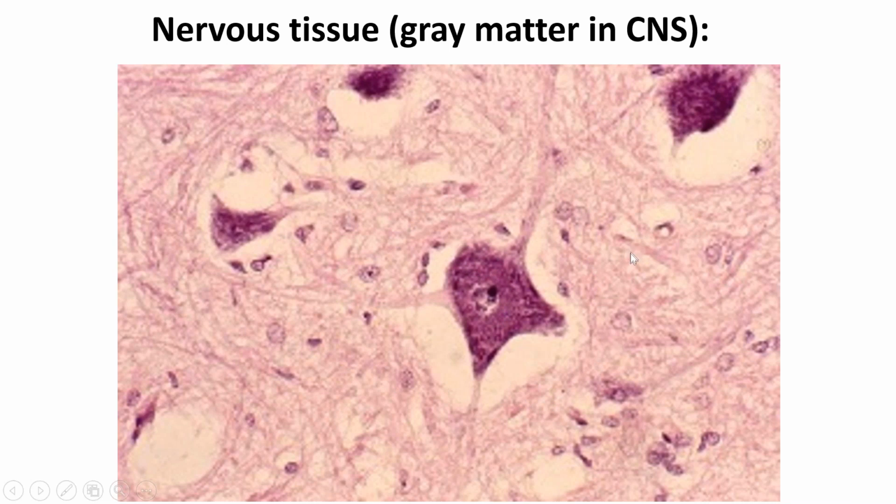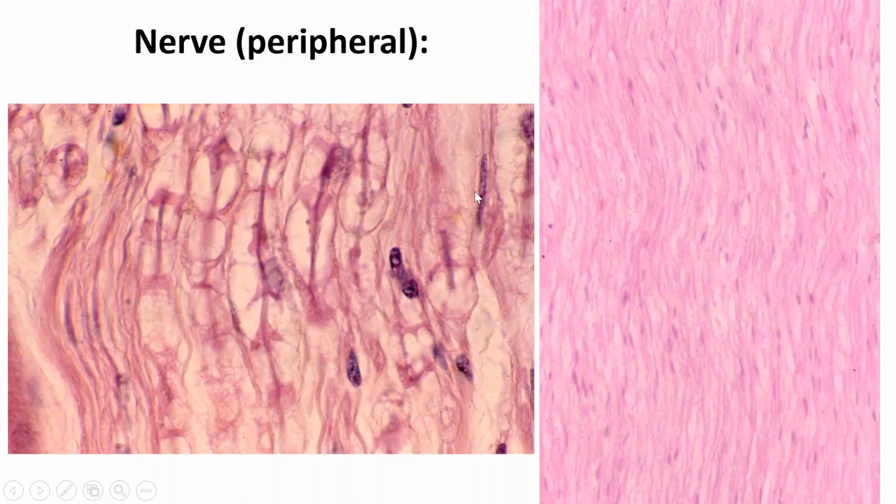So generally, we're pretty good at identifying nervous tissue and identifying neurons. But let's take a look at nerve. If I say peripheral nerve, it's kind of redundant because if one uses the term nerve, that means we're out in the periphery. I want to take a look at this with higher magnification and then pop out to lower magnification. Most of our nerves are highly myelinated. If you follow my arrow, we're going down the axon, okay?